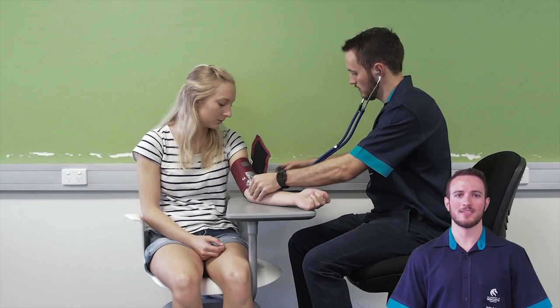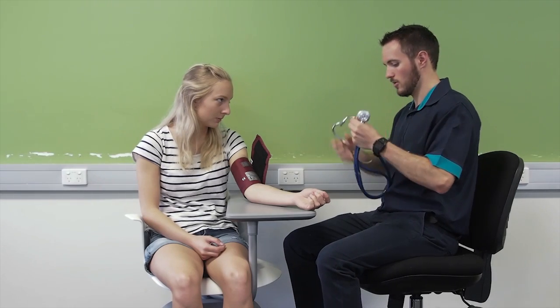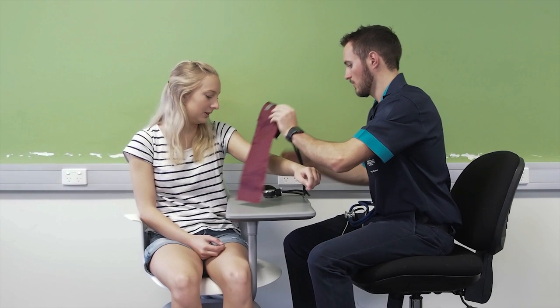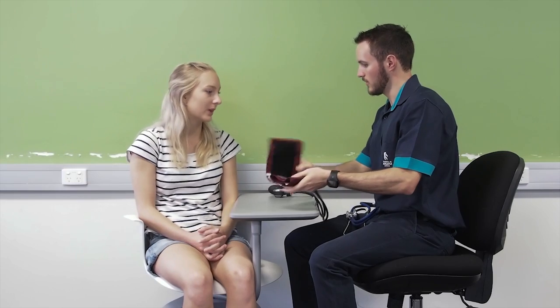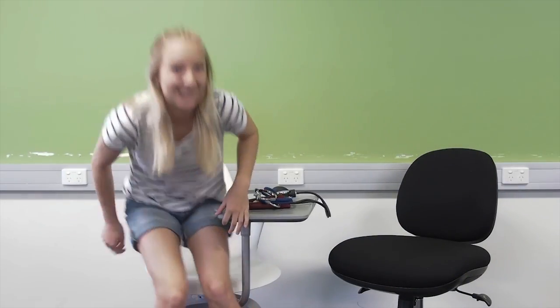Once there is silence, quickly release the pressure and remove the cuff to improve patient comfort. Thanks for that Nicole. Once the procedure is complete, clean the equipment as policy dictates and document accordingly. I'll just go clean the equipment and document this information and then I'll come back and take you to the ward.